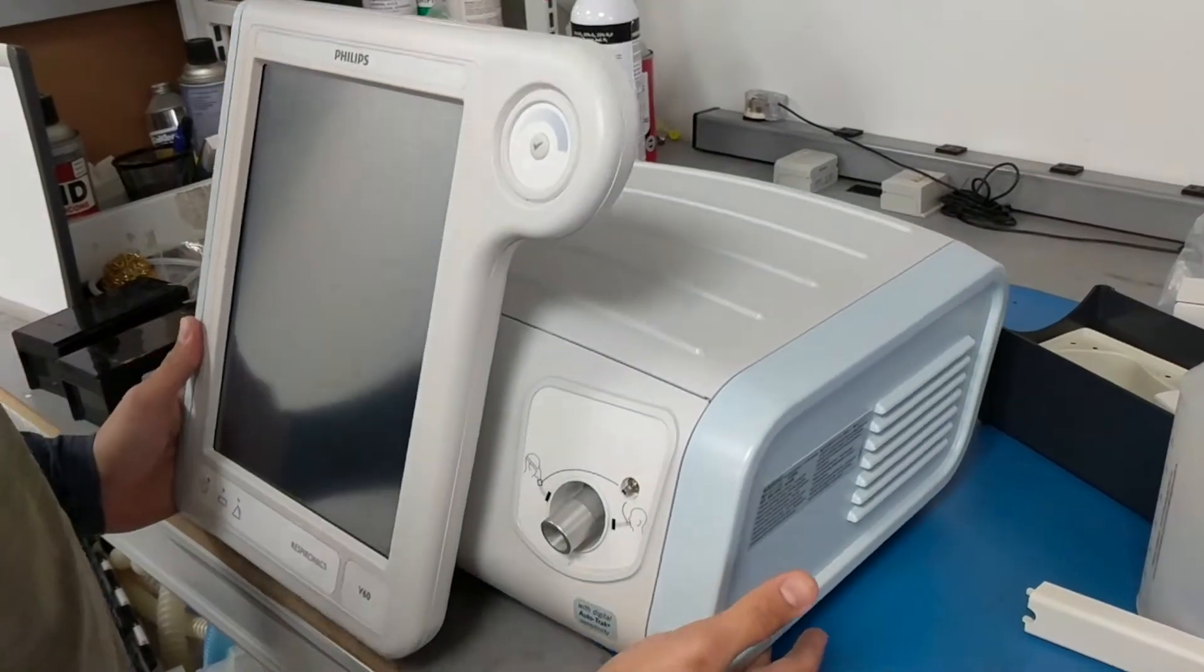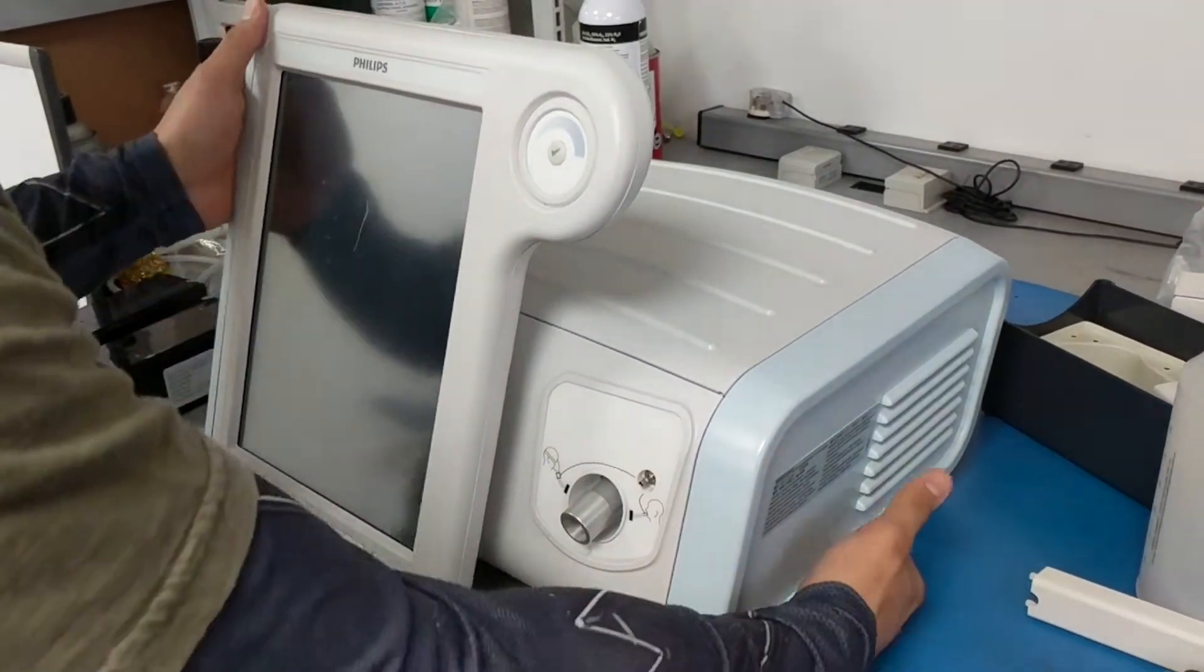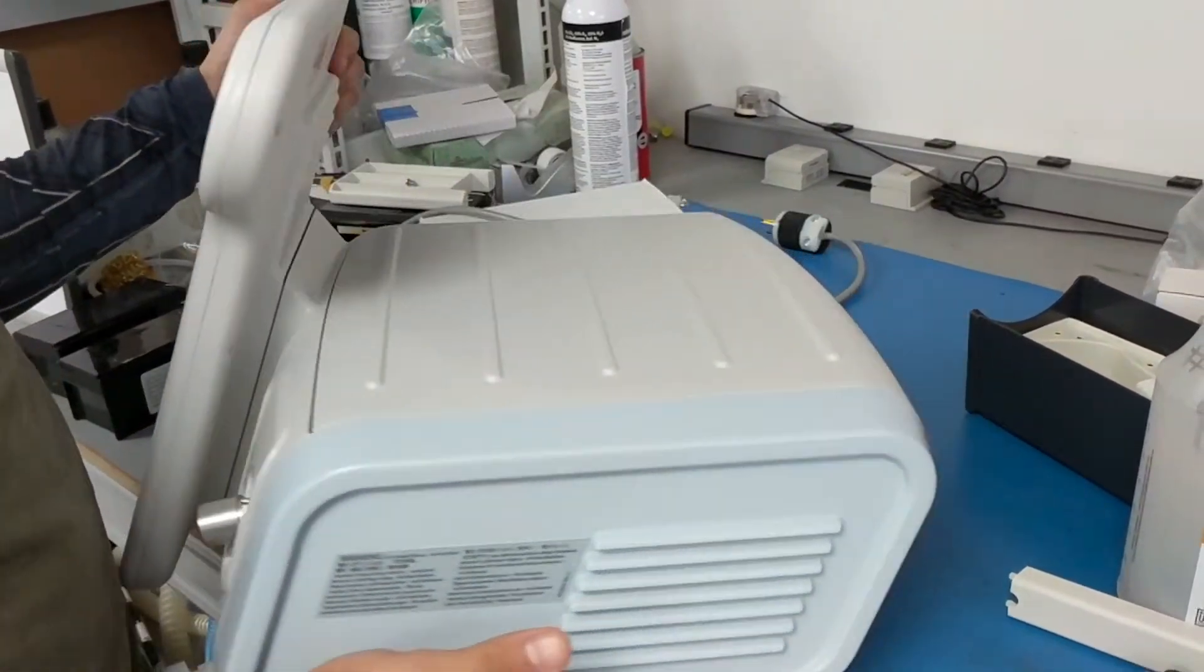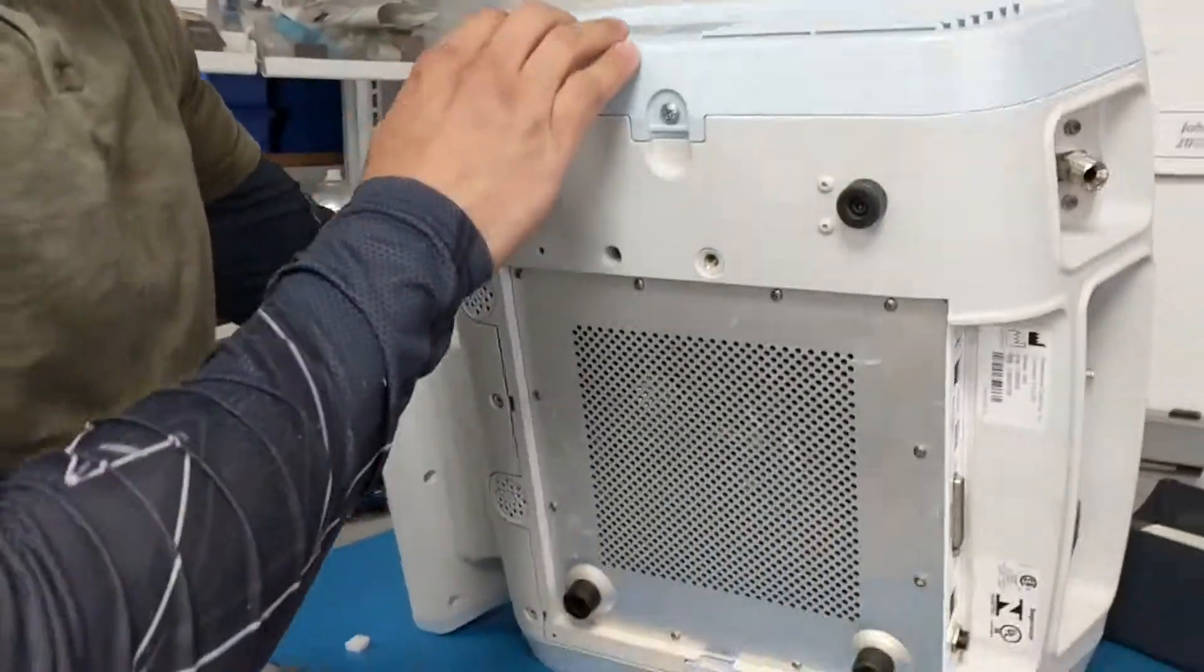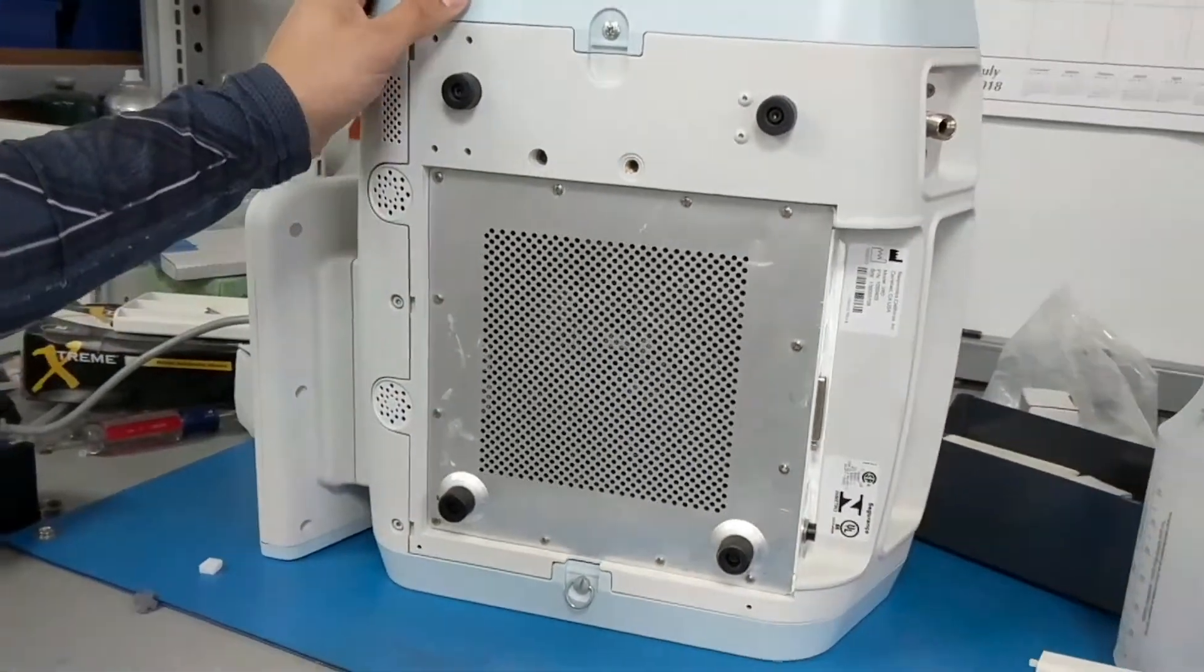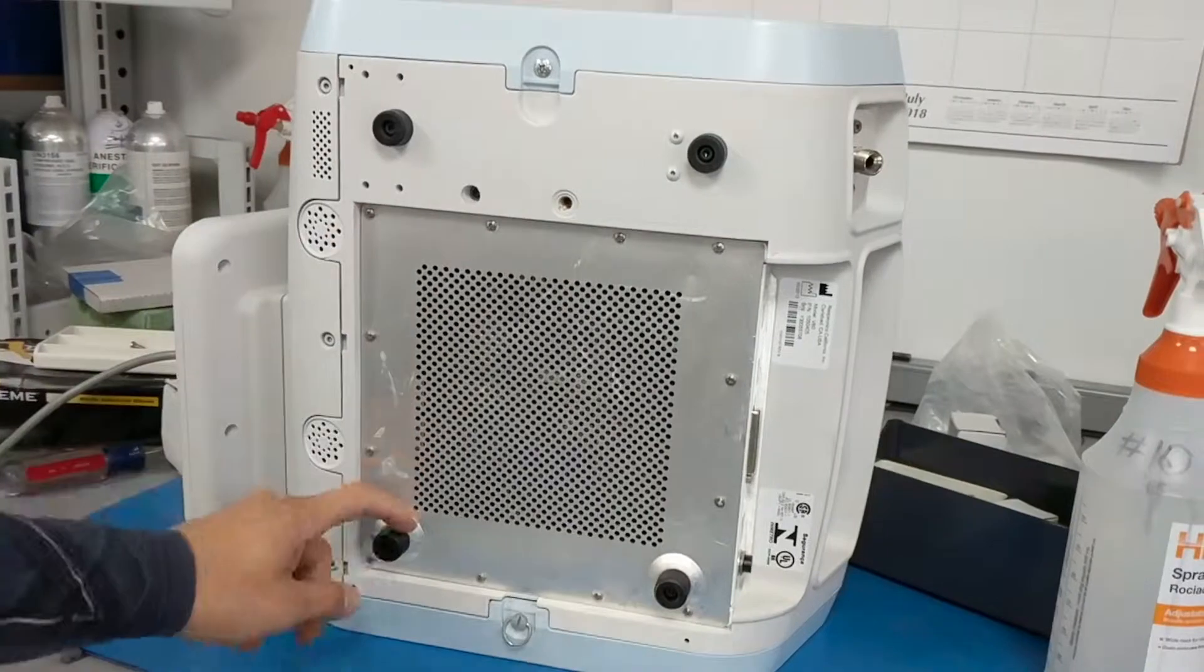As you can see, we have our unit here, Philips V60 facing us. If you turn it and you look underneath, you'll see four feet. This is how the unit will arrive with four feet.